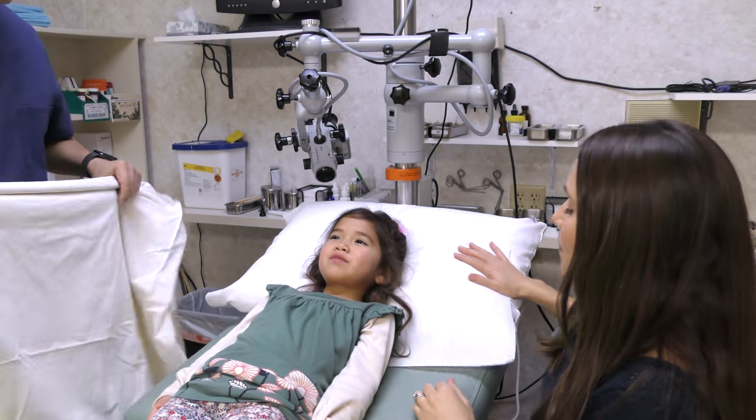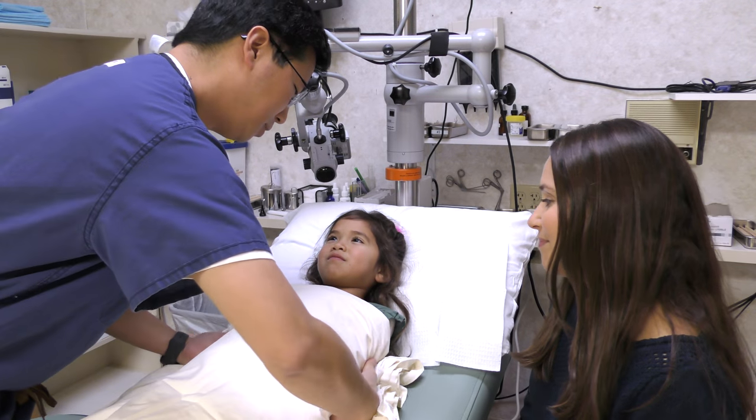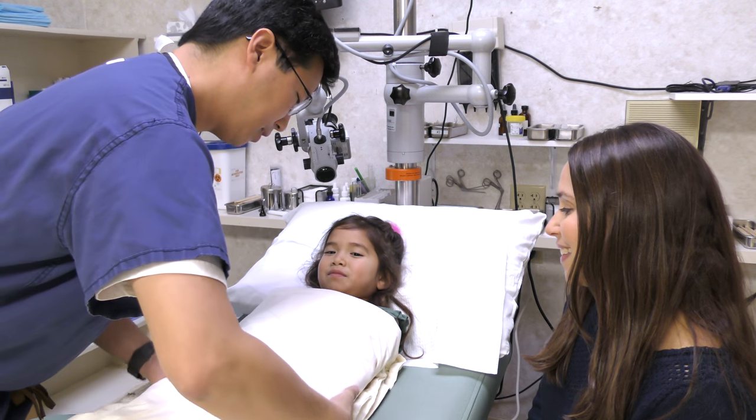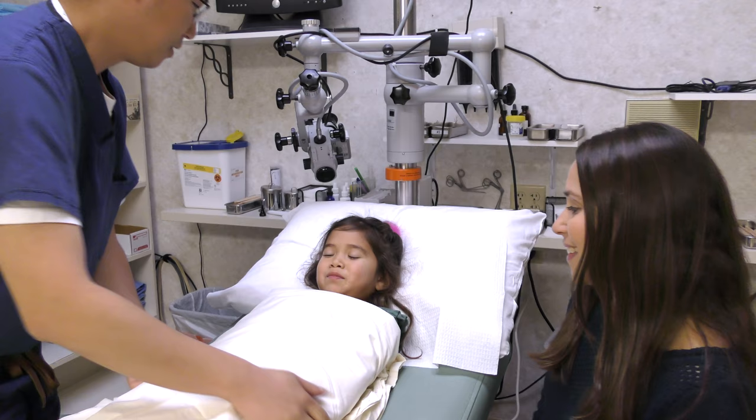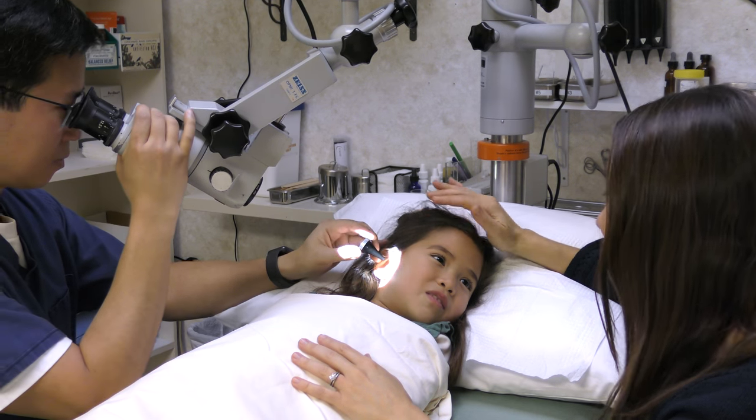Here's an actual video of a tube placement in an awake child. Note that the child is first strapped in a bedsheet to keep the hands down. The parent is present to keep the child as calm as possible. The same steps described already are then performed.